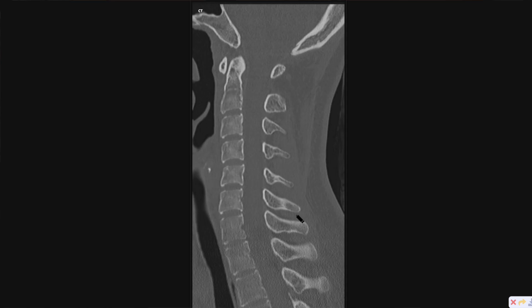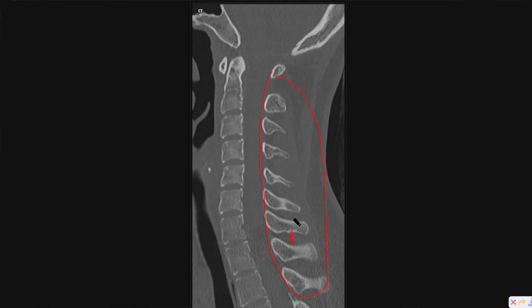These can involve the spinal cord, and typically there is ligamentous injury in these sorts of injuries. So I want to make sure that the spinous processes — the distance between them — is relatively consistent. You have to get an idea of what's normal spacing before you can call it abnormal. I look at these every time, making sure that the distance between them is consistent.